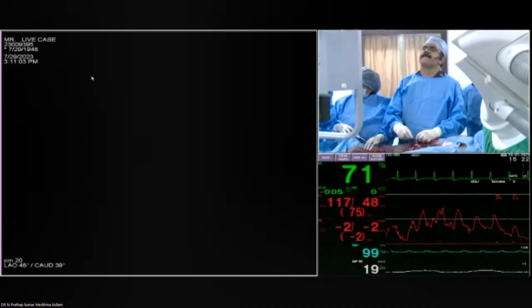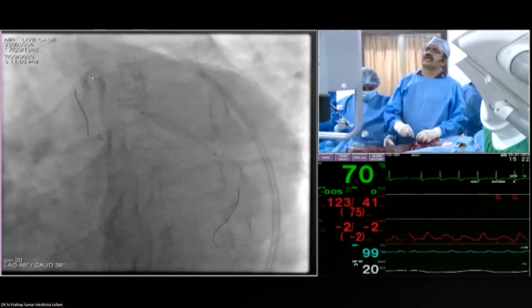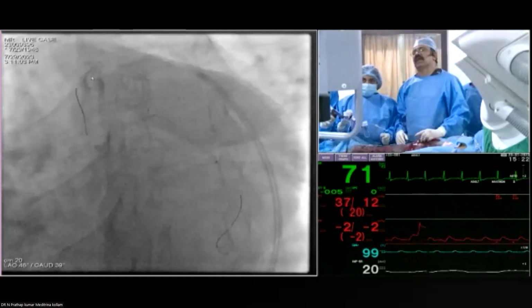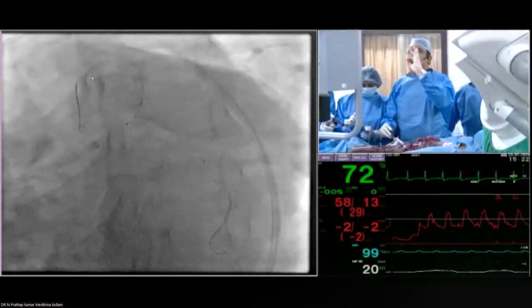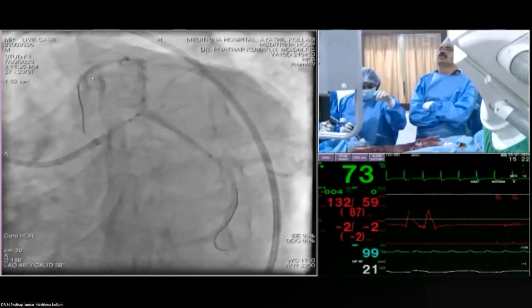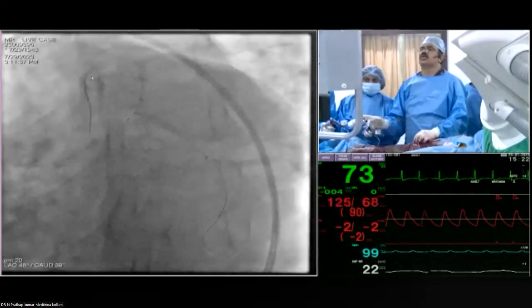Do you think that now that you've modified the bifurcation so much that it'd be relatively easy to wire this? I think it is. Let me see, the wiring is actually the thing I wanted to show people. I'm keeping this because it's a science stent. You can see the advantage of the science stent, the marker is at the ostium, not away from the stent. This looks like a perfect ostial positioning because the strut is extending up to the marker. So I think I can go ahead with a balloon, stent, go.